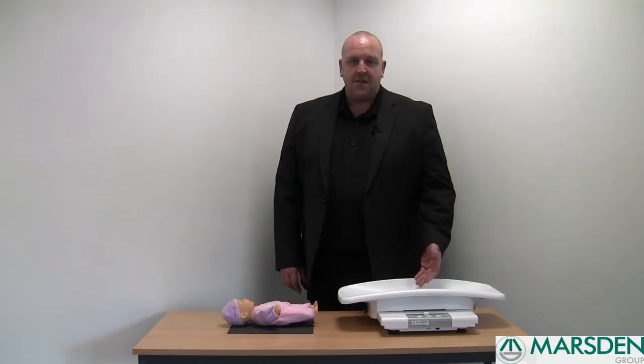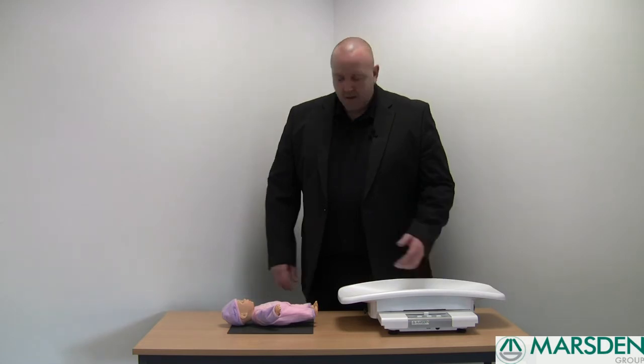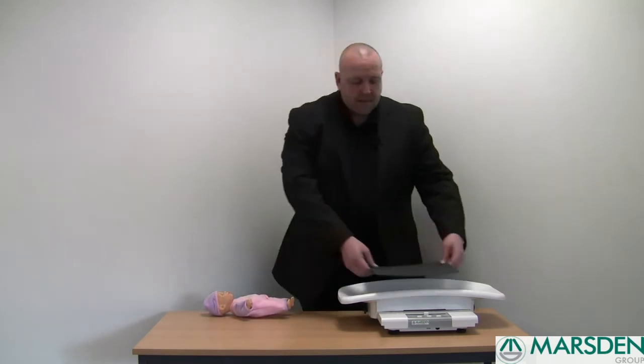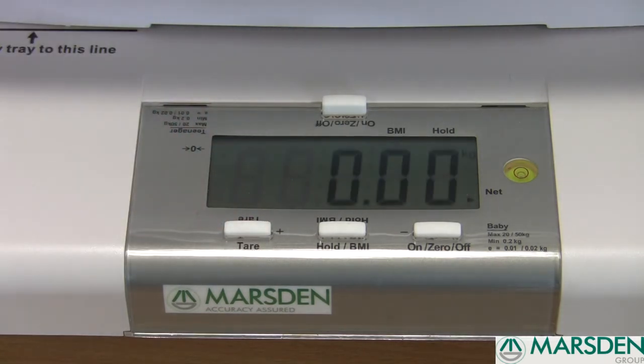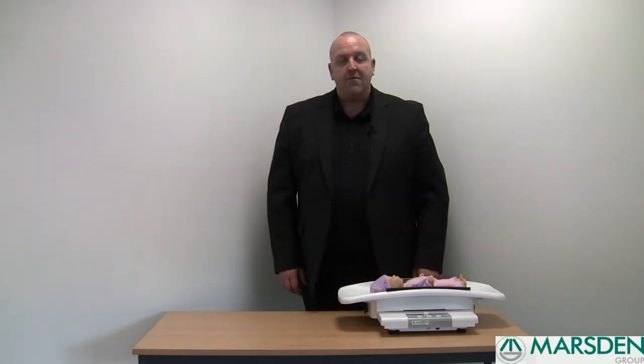This scale also comes with a tear function should you wish to place a baby's mat or a baby's blanket in the scoop. Simply place a mat in the scoop and press the tear button once. This will tear off the weight of the blanket or the matting, enabling you to place your baby in the scoop to get an accurate reading.